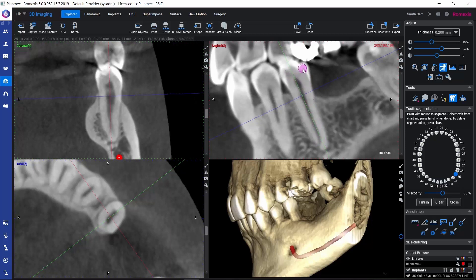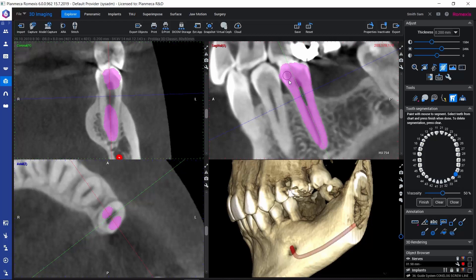This mouse cursor works as a painter tool and we can start painting by keeping the left mouse button down and tracking with our mouse. The color flows partly automatically, so it also automatically recognizes the borders of the tooth.